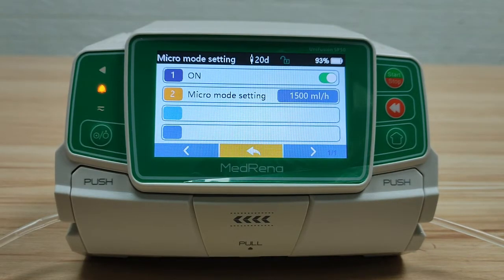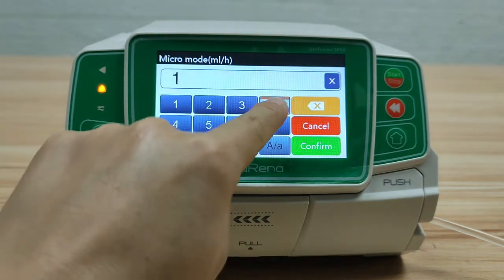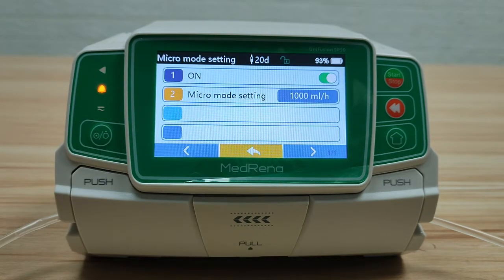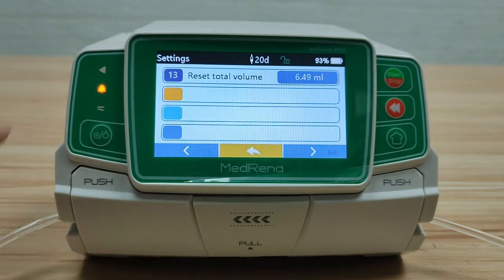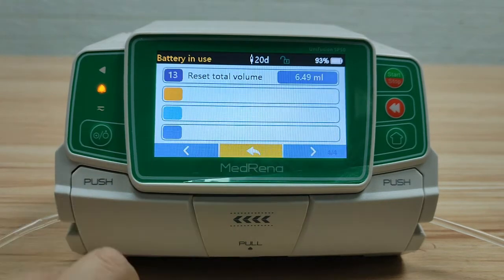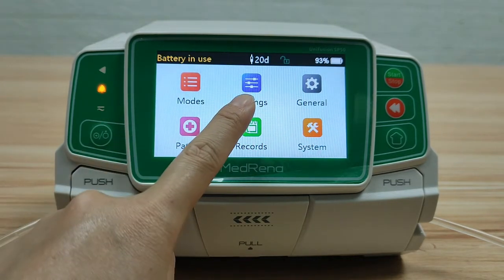By selecting On, set the maximum flow rate. By setting this number, the flow rate under the four infusion modes is not allowed to exceed the set limit — for example, 1000 ml per hour. Reset total volume: by selecting Yes, the data of infused volume will be cleared. This concludes the introduction of Settings.